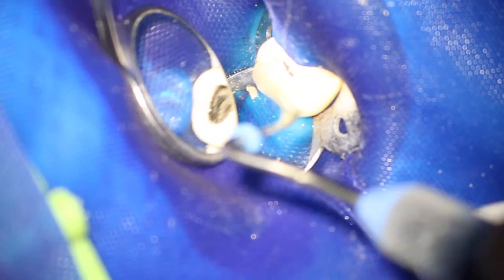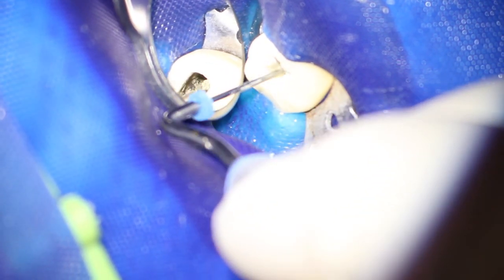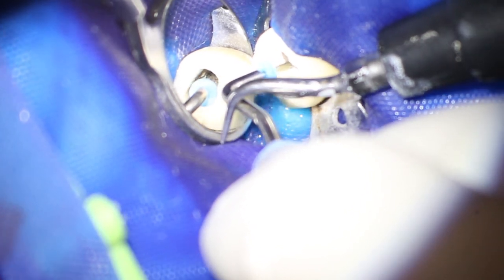Here you can see the cleaned gap, a very clean canal, and the open apex. This leads us to another opportunity to use ultrasound in endodontics, the compaction of MTA. Here we use the thixotropy phenomenon that we know when we make a plaster model. Also here we use vibration to make the plaster fluid in the same way it works with MTA.